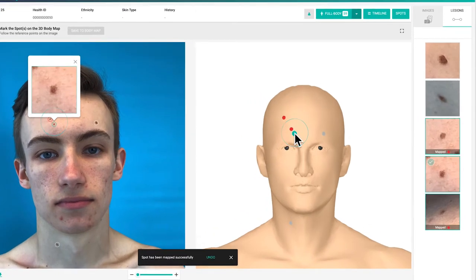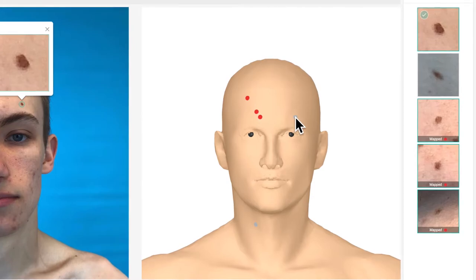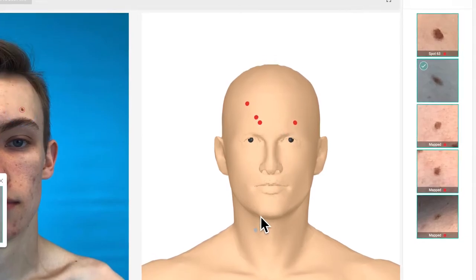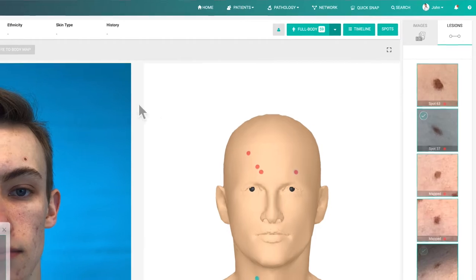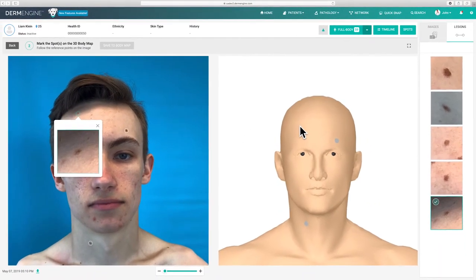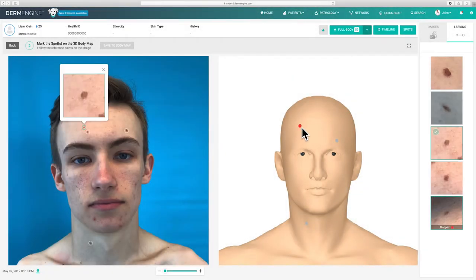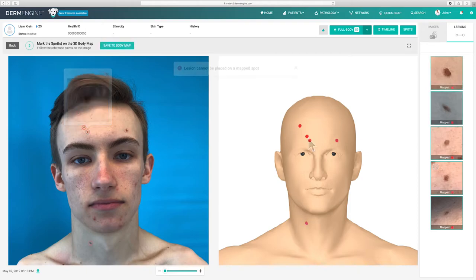Here, you can add a new spot or click on an existing spot, which will be a faint teal color to help you easily differentiate it. As you map the lesions, you'll notice them appear in the right side column. The existing spots will include their spot name and number. Please note, once a spot has been mapped, you have three seconds to undo, so you can take your time when mapping a new spot. For your convenience, the images and detected lesions tab will automatically switch based on your actions. Once finished, click save to body map.